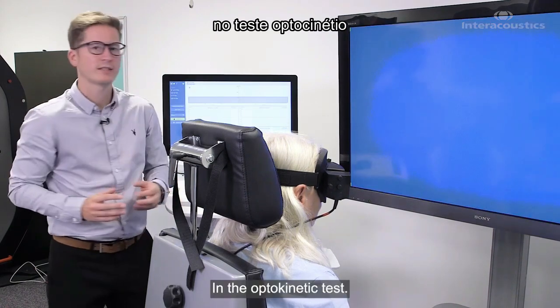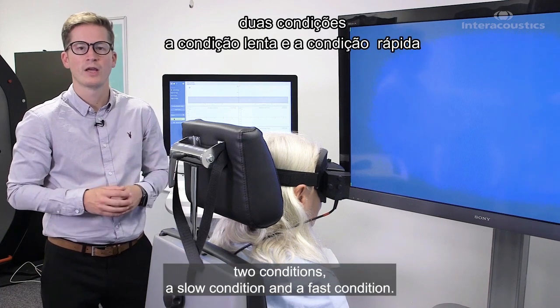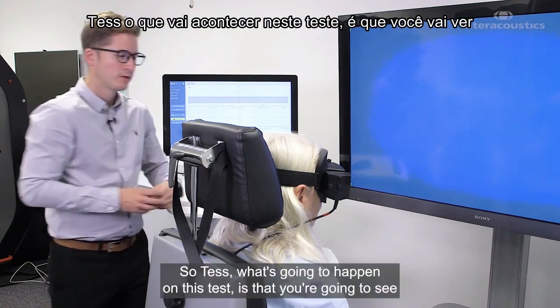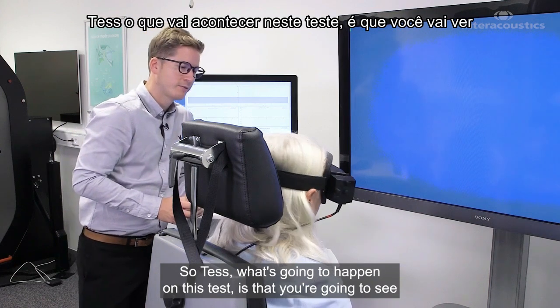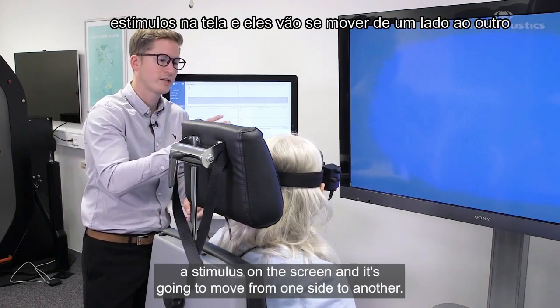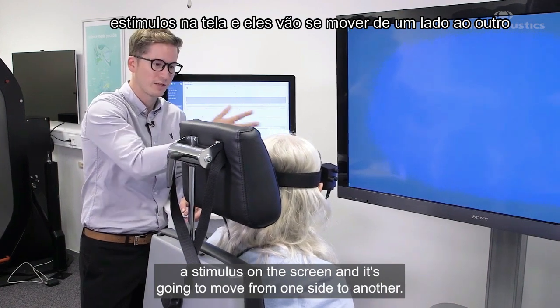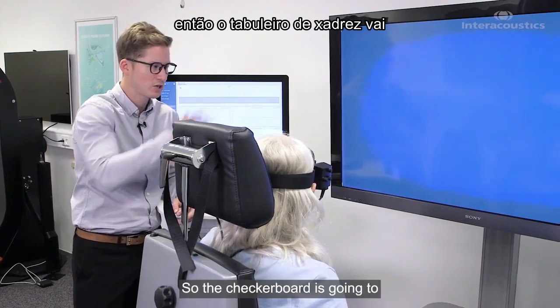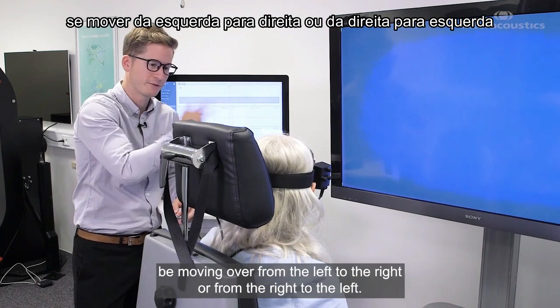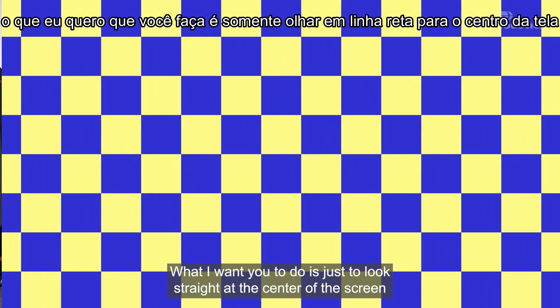In the optokinetic test, we're going to test two conditions: a slow condition and a fast condition. What's going to happen is that you're going to see a stimulus on the screen and it's going to move from one side to another — the checkerboard is going to be moving either from the left to the right or from the right to the left. What I want you to do is just look straight at the center of the screen and watch the pattern pass by.